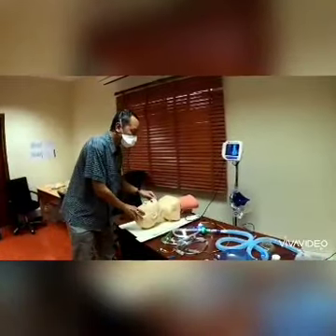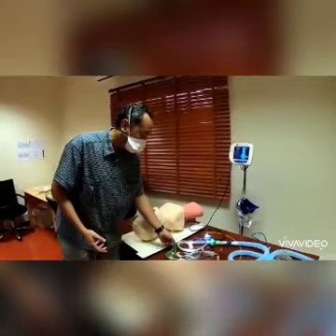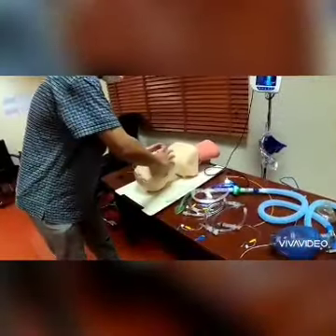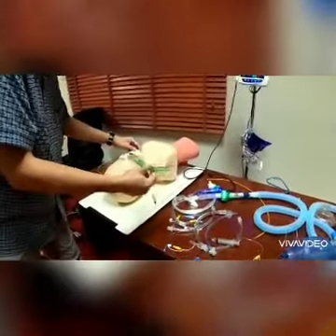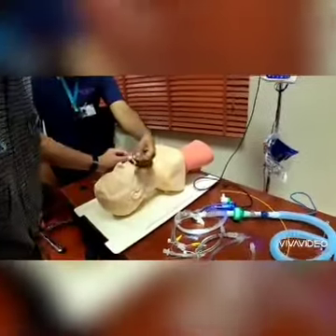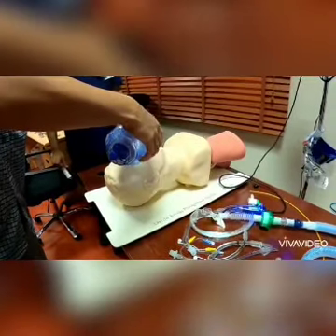At some point, you will either be successful in intubating the patient, or you think you have failed. If you felt you have failed the intubation, then you should proceed very quickly to try to oxygenate the patient. We will not do BVM. If we can avoid it, we'll go straight for an LMA, ideally LMA size 4 for an adult. You would open the package and just go straight into the patient's mouth. You'll inflate it, and you'll ventilate the patient.